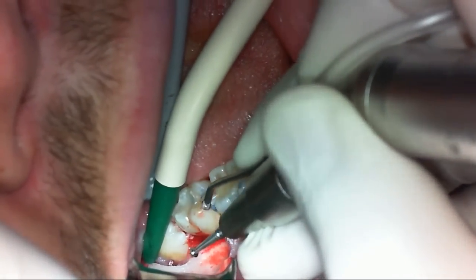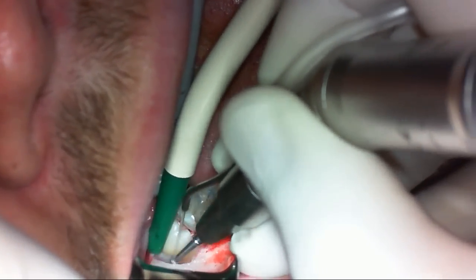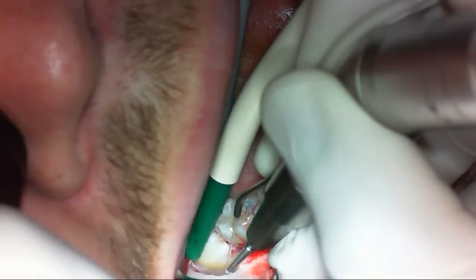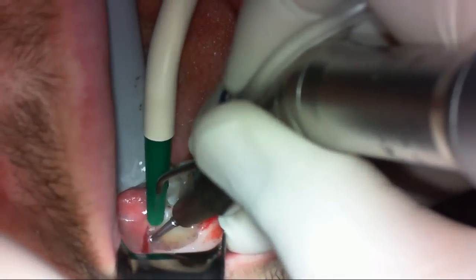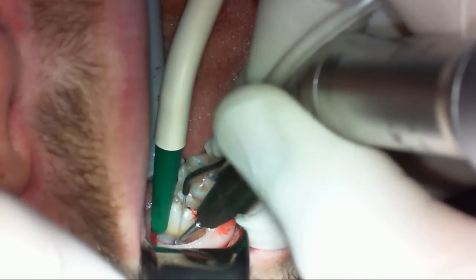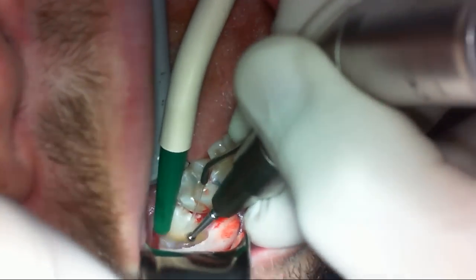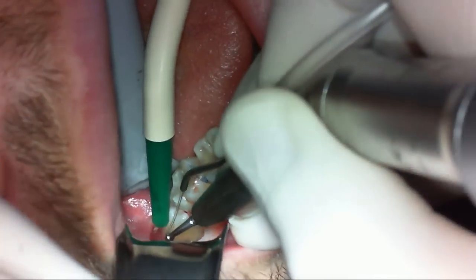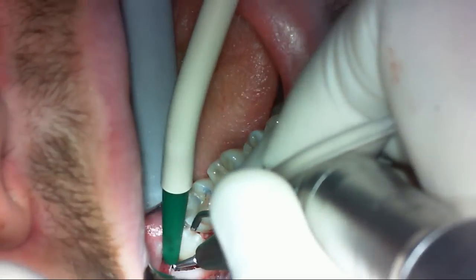I usually start my gutter from distal to mesial so I can see it better. Get your assistant to place narrow suction on the distal part of the gutter where water will run. How deep should the gutter be? I want to get it deep enough to see some bleeding in the bone — bleeding indicates I've removed the cortical bone and I'm into the cancellous, softer bone. Also, if you can see the furcation, it makes it much easier to orient your bur when sectioning.